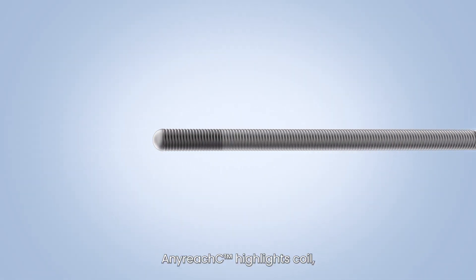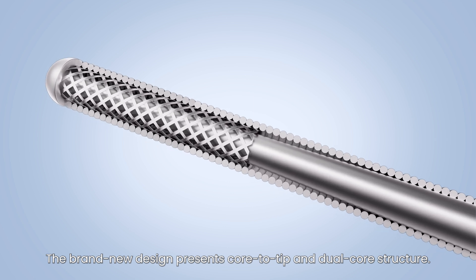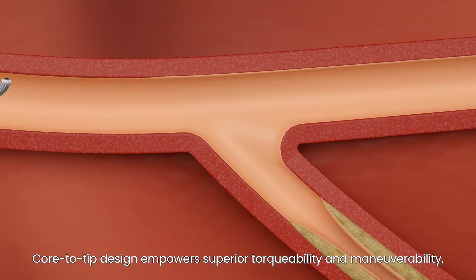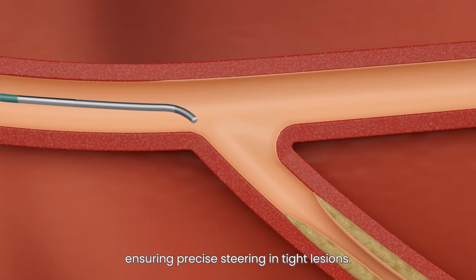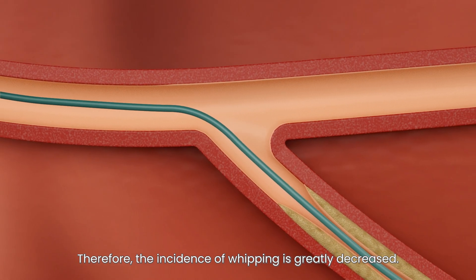AnyReach C highlights a coil, bringing you better tactile feedback. The brand new design presents a core-to-tip and dual core structure. Core-to-tip design empowers superior torqueability and maneuverability, ensuring precise steering in tight lesions. Therefore, the incidence of whipping is greatly decreased.